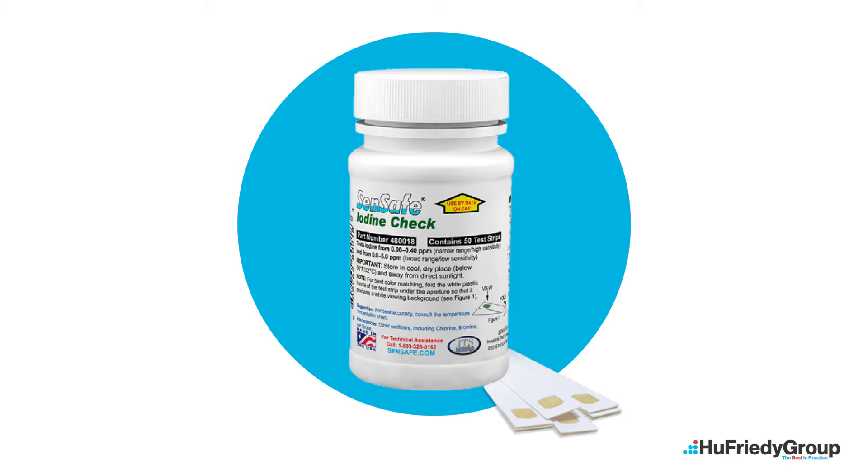Iodine test strip use is intended to determine the level of iodine present in dental unit water lines. This level is called the parts per million or PPM. Iodine test strips are not to be used to measure the presence of colony forming units or CFUs.